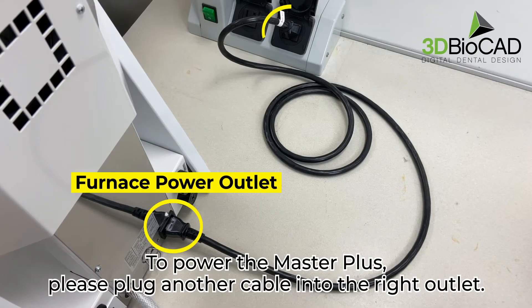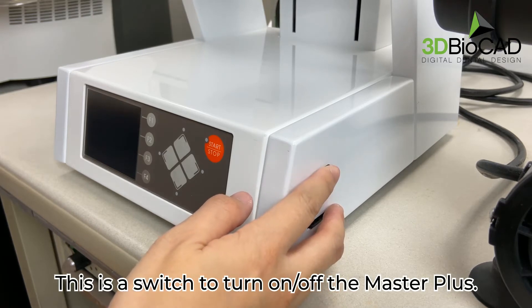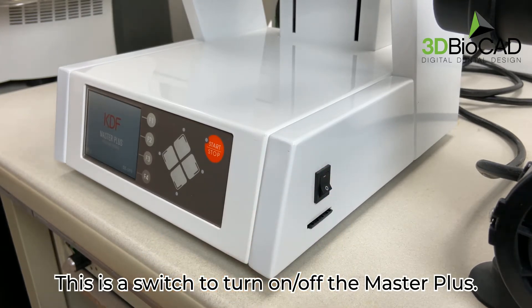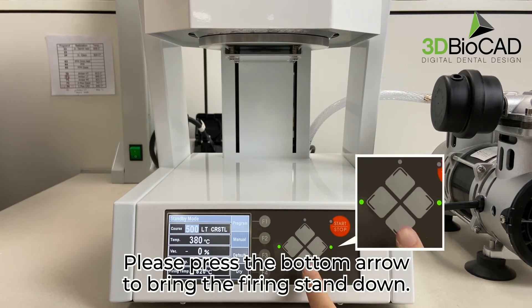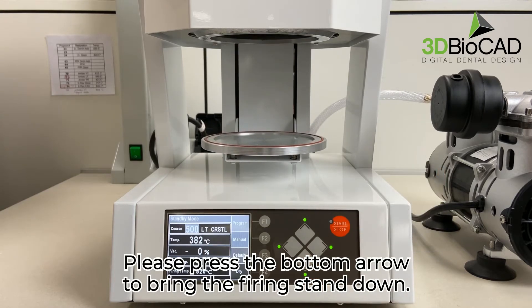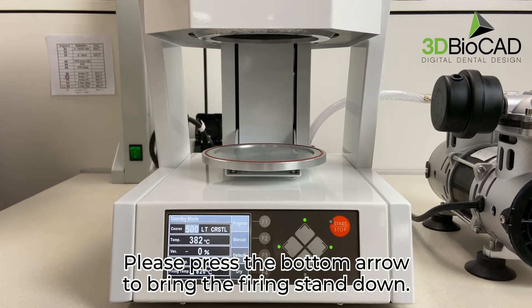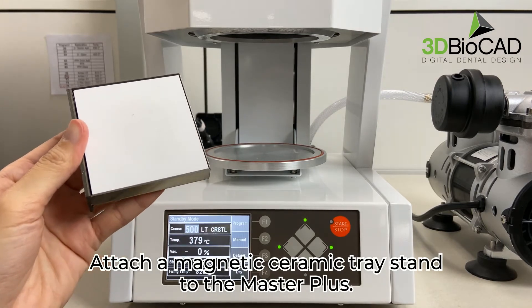To power the Master Plus, please plug another cable into the right outlet. This is the switch to turn on and off the Master Plus. The temperature will automatically go up. Please press the bottom arrow to bring the firing stand down. Attach a magnetic ceramic tray stand to the Master Plus.